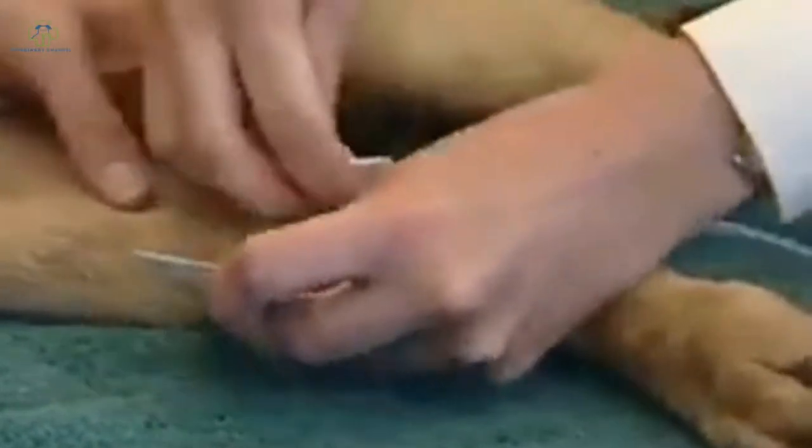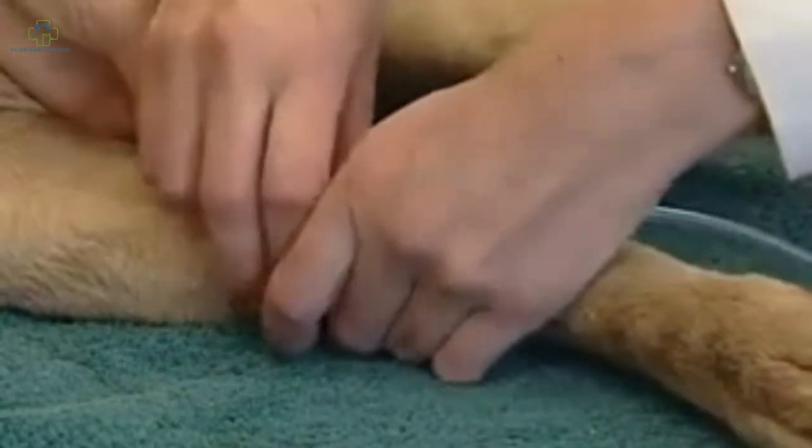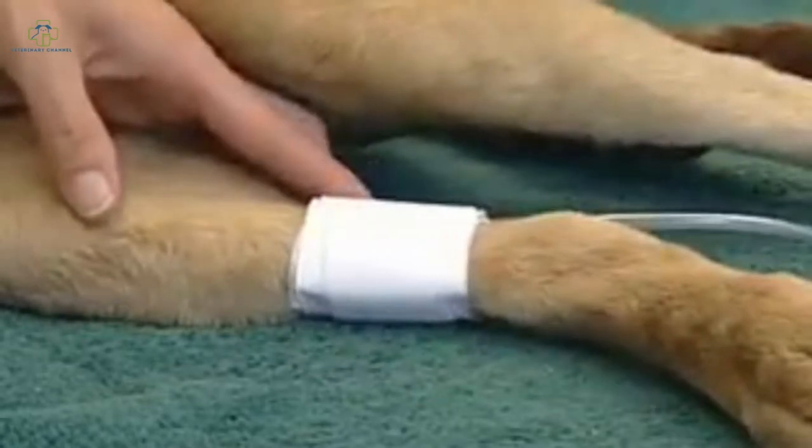Once we've selected our cuff, we're going to go ahead and place it in position. It's usually best to secure it with a piece of white tape to avoid the cuff from popping off.